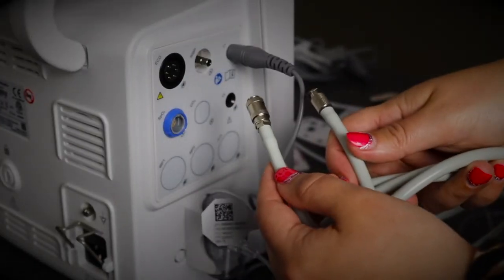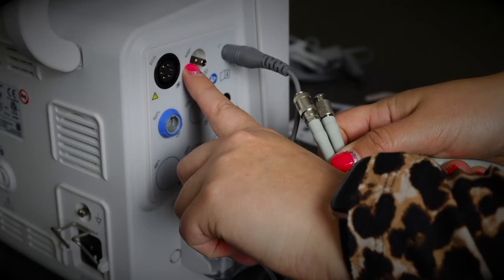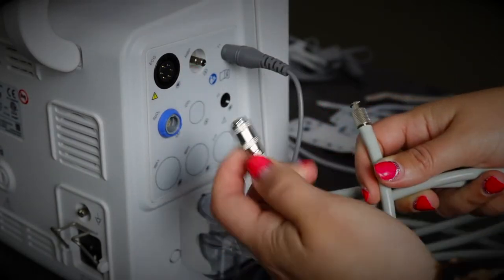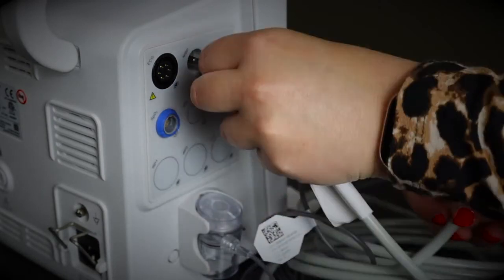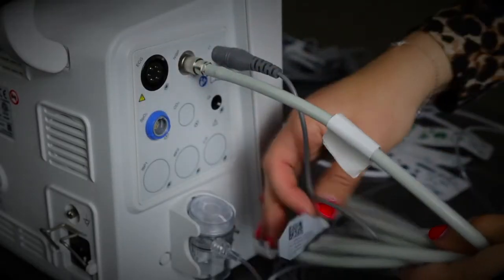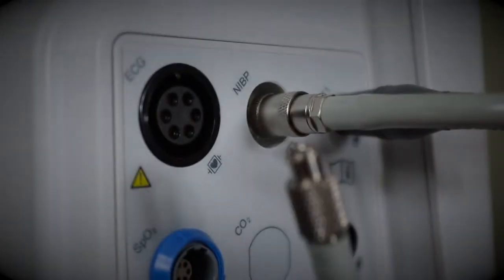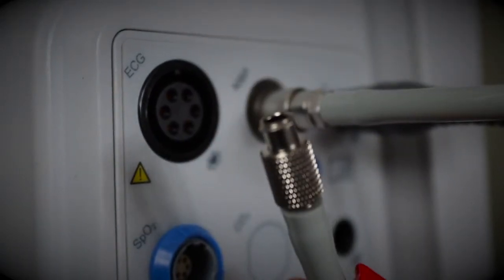This is the tubing for the non-invasive blood pressure. On the side of the machine you have NIBP. The end with the little twisty bit attaches to the machine — you pop it on, hold it, and twist it, and it's attached. The other end attaches to the cuff, which then attaches to your patient.